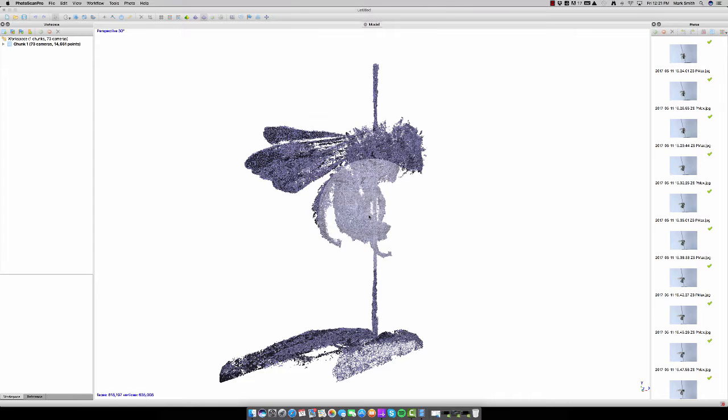So we're going to go ahead, we're going to press OK, and again, we're going to let this process. This process, as you can see, is happening pretty quickly. So what we'll do is we'll just sit back and then just speed this time up for you, and then we'll resume where we left off.